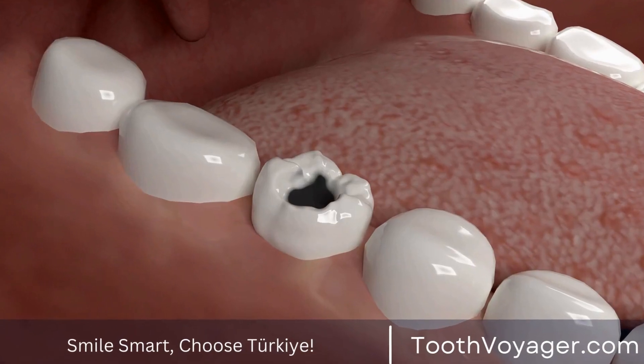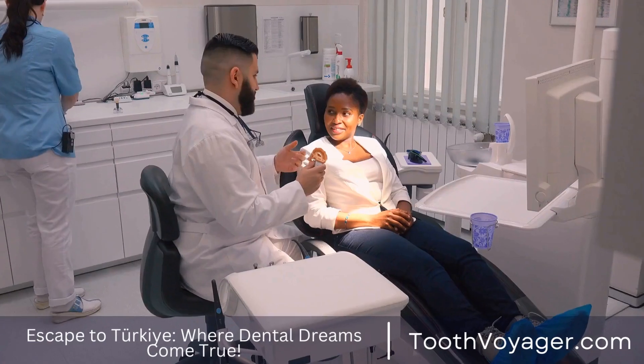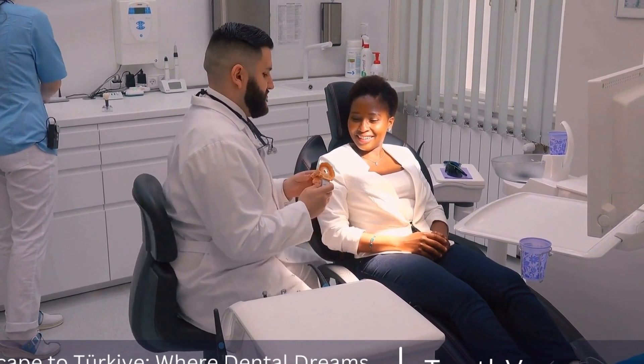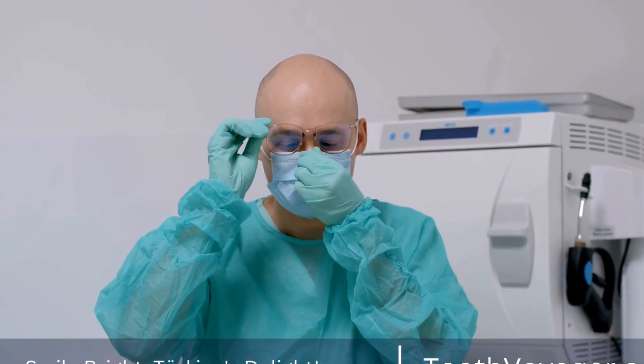These custom-made caps are designed to fit over the existing tooth to restore its shape, size, strength, and appearance. But what many people don't realize is the artistry and craftsmanship that goes into creating these functional restorations. In this video, we will explore the process of crafting custom dental crowns and the skilled professionals behind them.